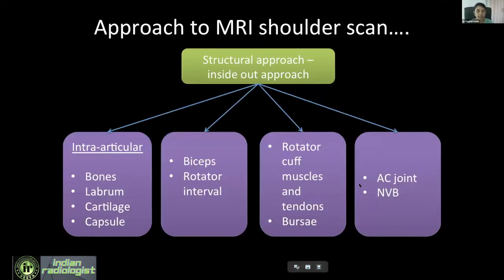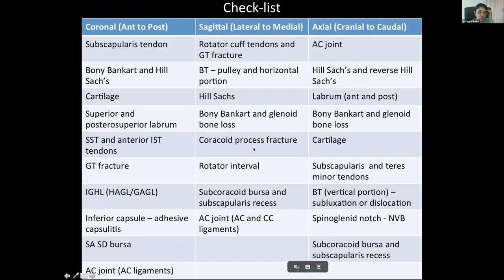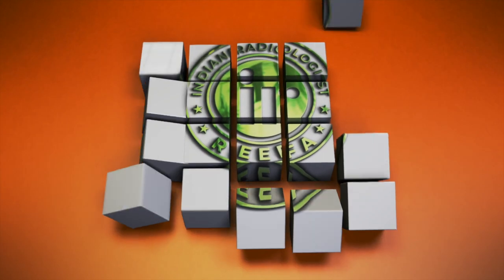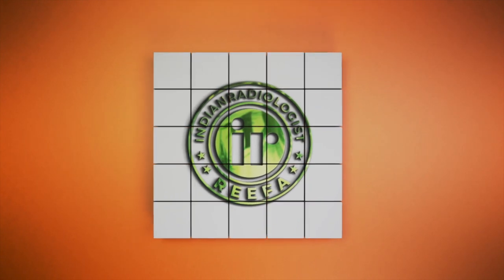To sum up: always have an approach to read any scan. Make your own approach and be comfortable with what you are doing. Use this checklist to look at structures in different planes. In coronal, go from anterior to posterior through the important structures. In sagittal, go from lateral to medial. In axial, go from superior to inferior. Though one particular structure may be seen better on one plane, always correlate on other planes so that you are 100% sure of your findings.